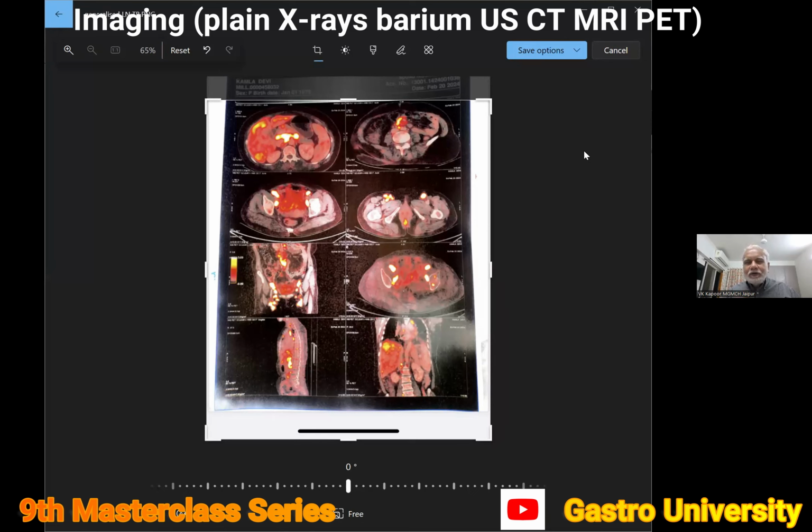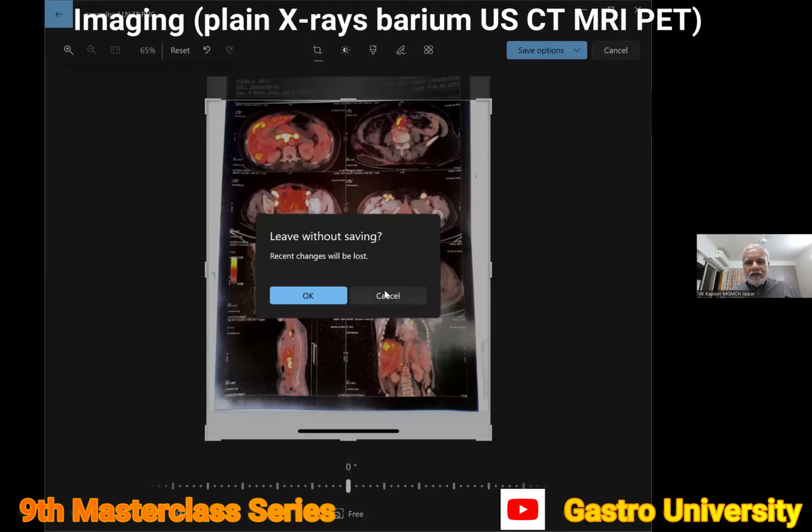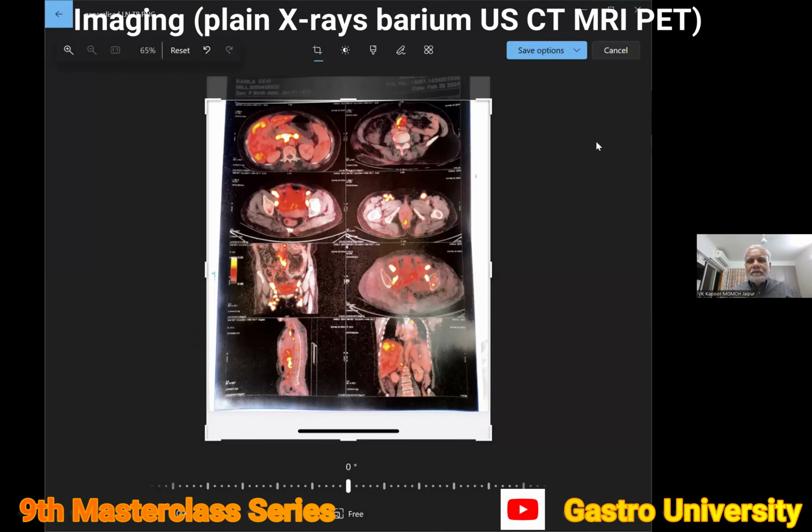So just to highlight what Dr. Gambhir said. And of course, the counter is that it can create problems by showing a false positive lesion. It lights up like a malignancy in cases where we are thinking of malignancy, but it is not malignant. Tissue has to be taken for the final diagnosis.